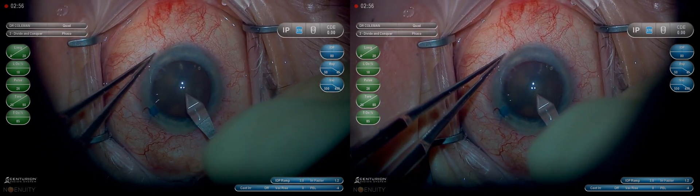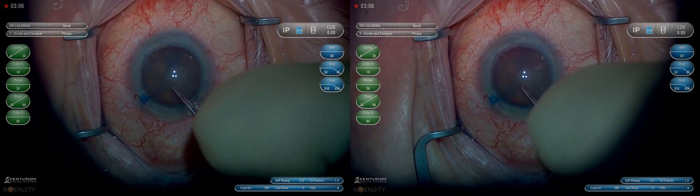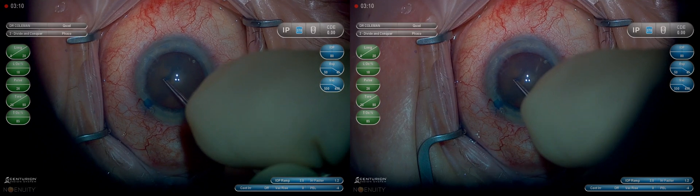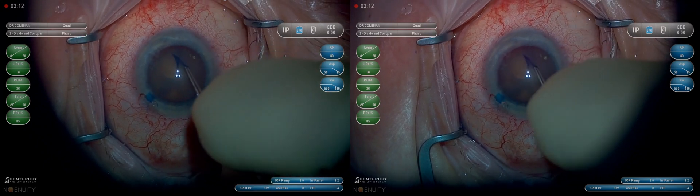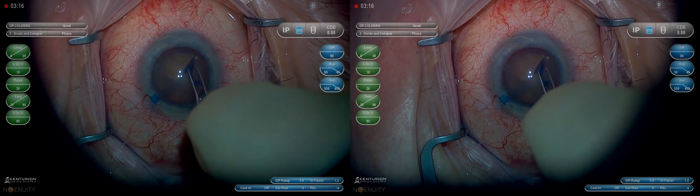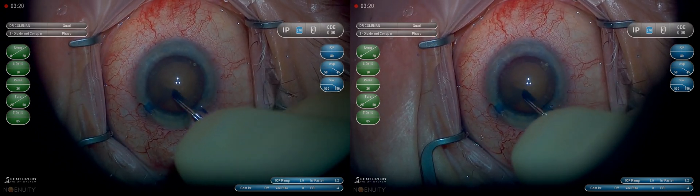I like to puncture the capsule with my keratome to create a very definite point to begin my capsulorhexis. On these dense cataracts we have to make sure that it doesn't tear out — a lot of times it has a tendency to. This one seems to be fairly well controlled and I made it a slight bit larger than I normally would in preparation to use the MyLoop.